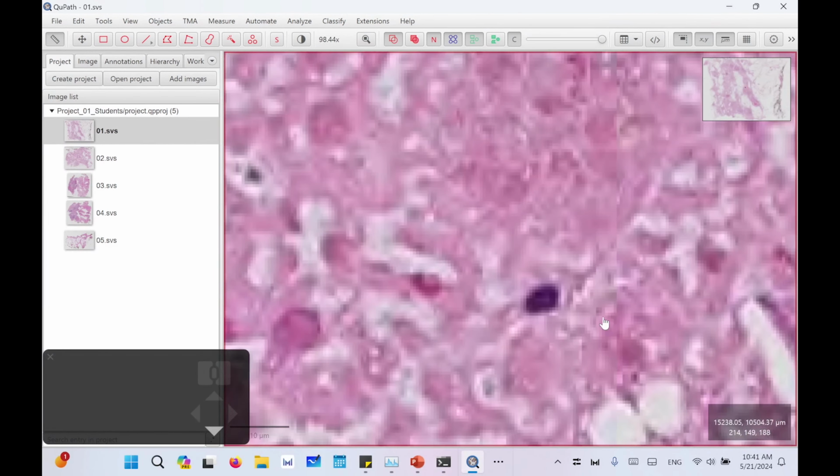So let's zoom in. For example, the pink purple parts or regions here can refer to nuclei. If you open another slide by double clicking on it, you can zoom in to get the fine details. As you see here, there are some nuclei, and white regions can refer to adipose or fat, and cytoplasm, and so on. The next step, we need to change the brightness and the contrast of the displayed image by clicking on that icon or pressing Shift C.